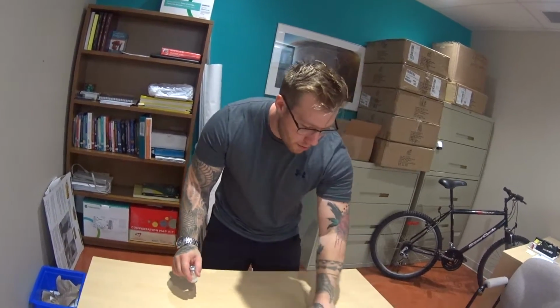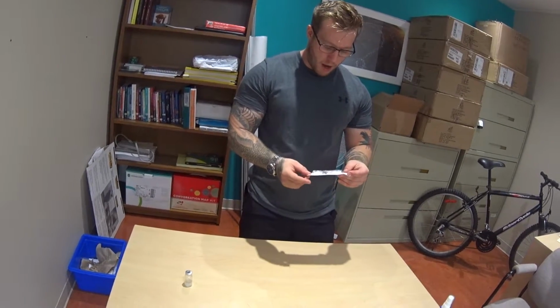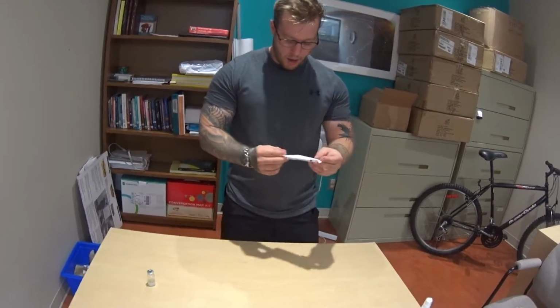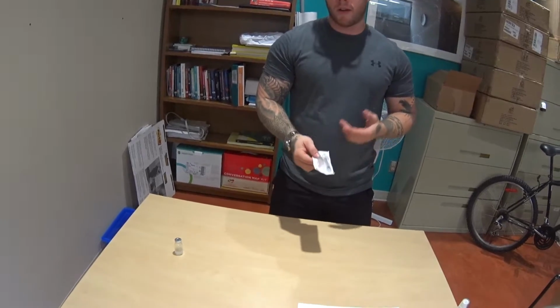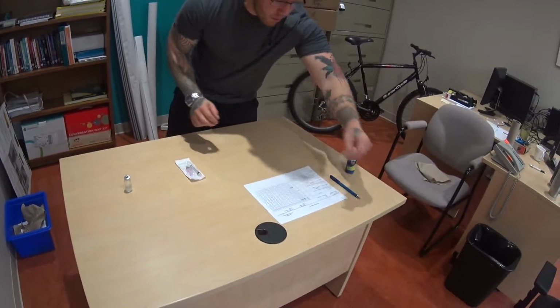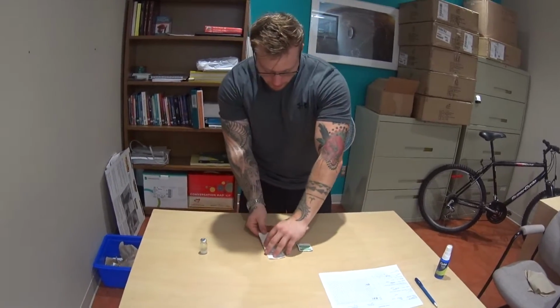I'll prep my equipment now. So we have our medication, but I'm going to pull out my syringe and needle, which came in the same package, which is convenient. So we have a 3 ml syringe, and the needle is a 22 gauge, 1.5. Perfect. I can use anywhere from a 22 to 25 gauge, and I'll be doing a deltoid IM injection on Joe Milton. He's an average build, so that'll be perfect for him. So we have our needle and our syringe, and we have our alcohol swabs as well.